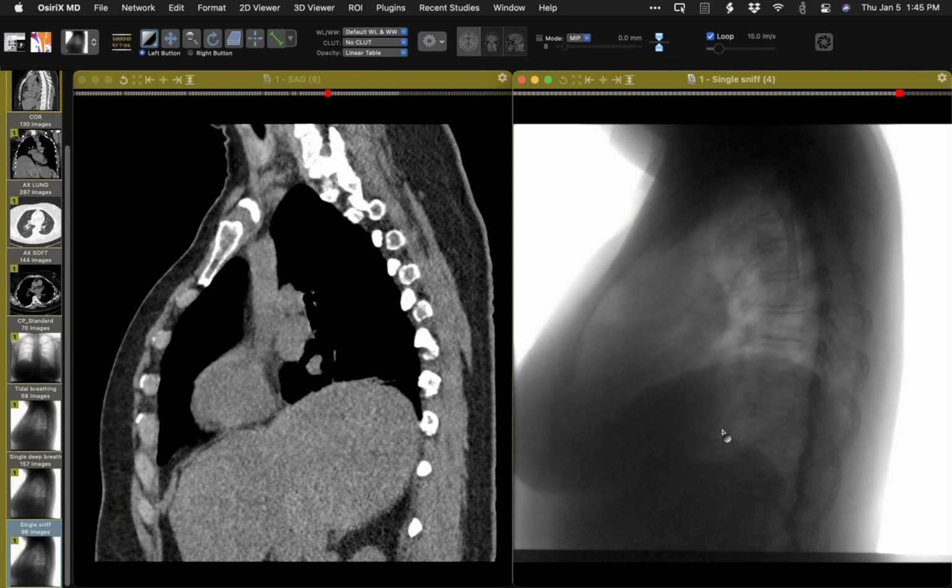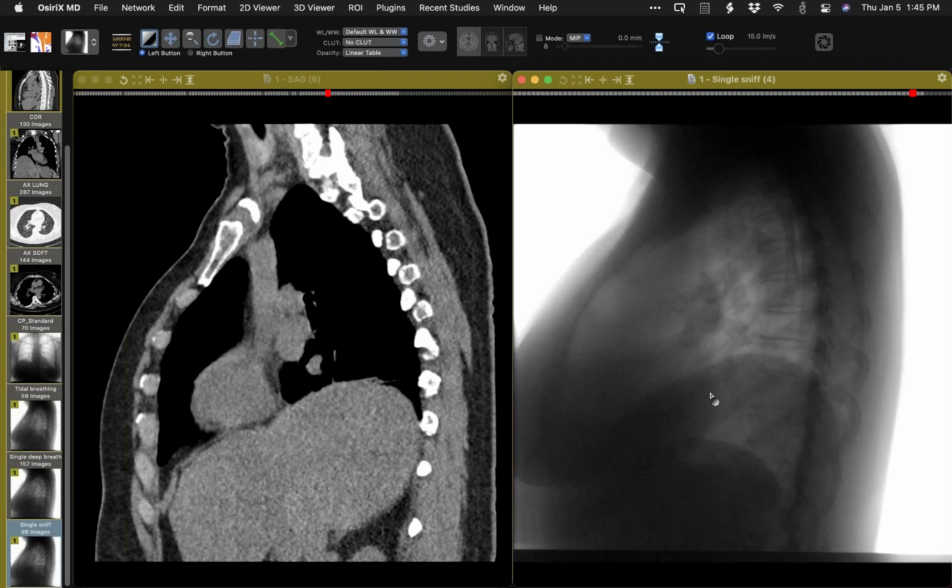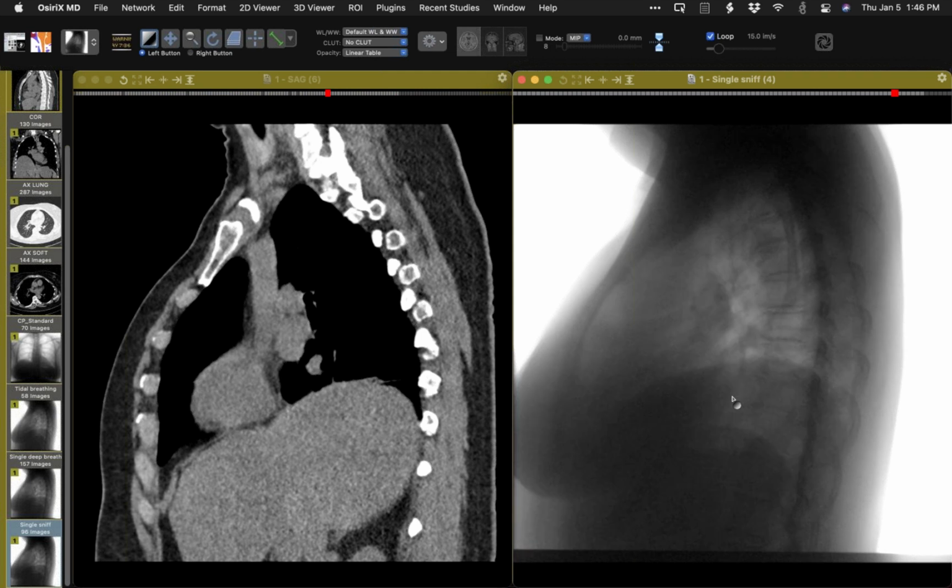right there. And this is going to really nicely show that with the sniff, this portion that's muscularized contracts, it moves down. This portion back here is going to move paradoxically, not very much, just a little bit, like right there. So the findings are not paralysis. This is eventration. And David, I know you'll like this because you are the one that taught us to evaluate the diaphragm this way and to look for the paradoxical elevation involving just a portion of the diaphragm, whereas the anterior portion moves down with the sniff, just like that, right?